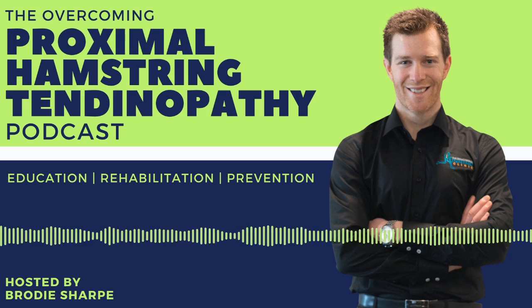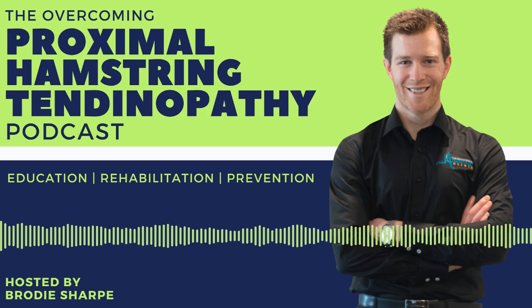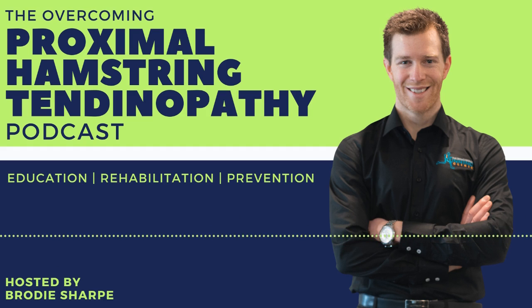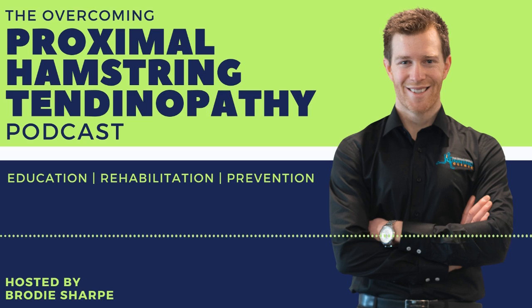The way I explain it to the patient is, if you've been to the gym and had a very good workout, the full benefits of the exercise you get while you're sleeping, not necessarily when you're doing it. The same thing with Shockwave: the full benefits happen 12 weeks after your last session. This is a very crucial point where people are a bit disappointed. Let's imagine you've got an Achilles patient and you give 3 sessions; the full benefit of the treatment will take 12 weeks after the last treatment. So therefore, it's not a quick fix.